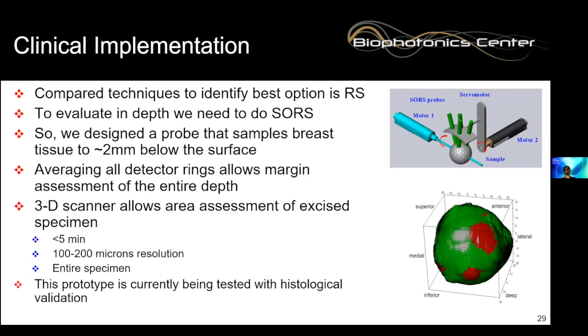That's a 3-dimensional scanner that we've developed with co-registration with white light imaging, so that we know exactly, we can map 1-to-1 the anterior, posterior, ventral, dorsal sides of the lump coming out of the patient as we do. And this is being evaluated as well.